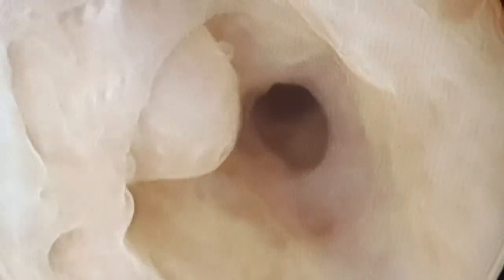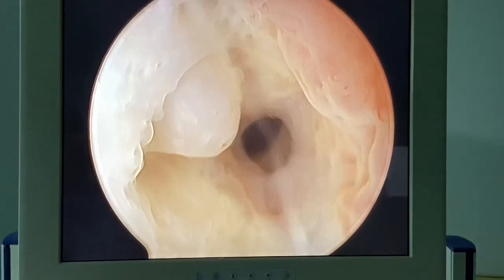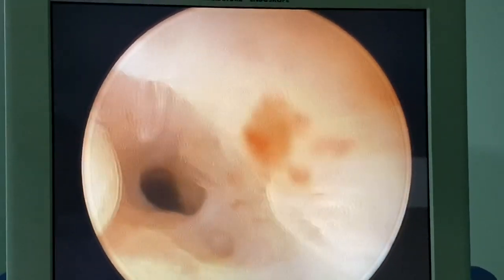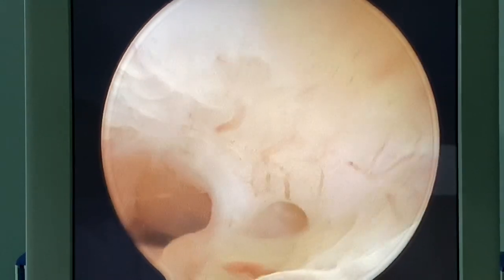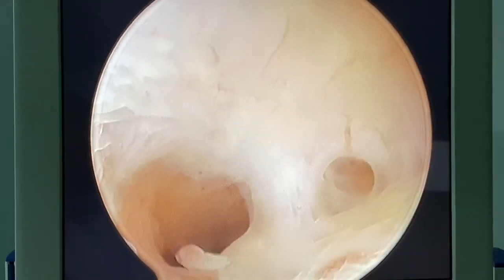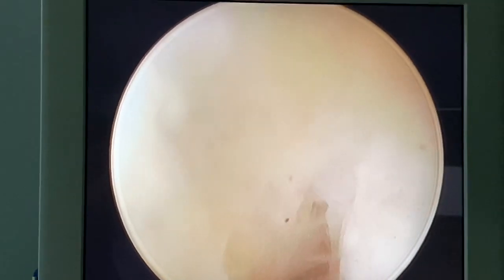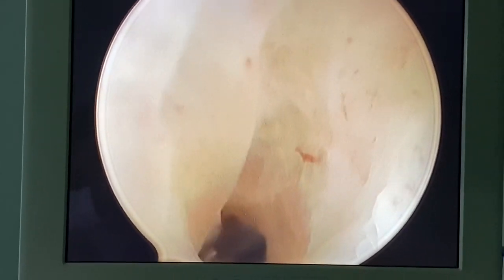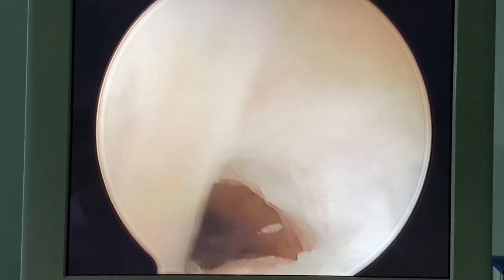Give it time for the fluid to open the internal os. This is a starting Nabothian cyst. Now sit down and gently negotiate the internal os — hands down very much. Gently negotiate the internal os, rotating the telescope, always keeping the tunnel view. You see the tunnel view? Gently in, breaking the adhesions.